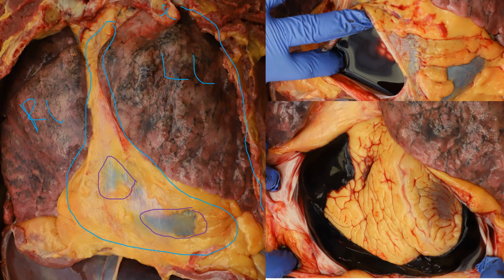So I like to pause. We have great photography here at Michigan Medicine. I definitely want to take photos of what it looks like in situ. I want to get my measured suction ready as well as measuring cups to record that volume, because it'll present with a little bit of loose blood that we see on top here, as well as clotted blood, both of which you want to record. And then once we see that, we've got to figure out, well, what's the source?